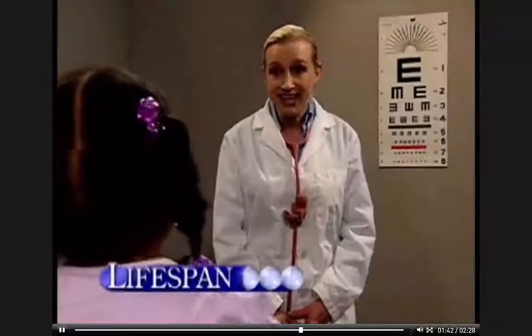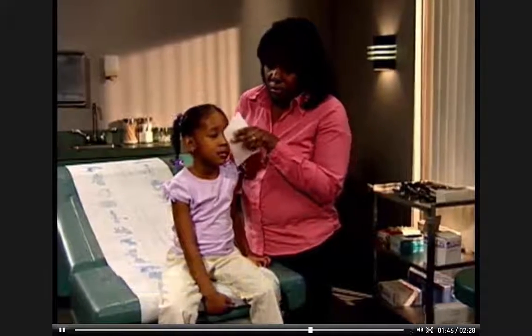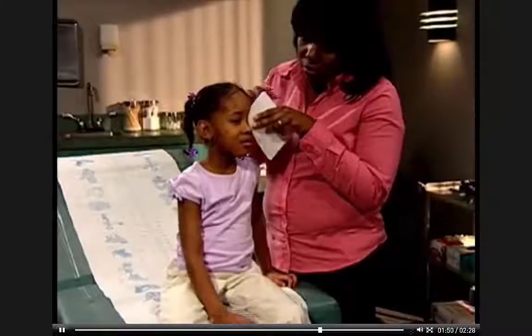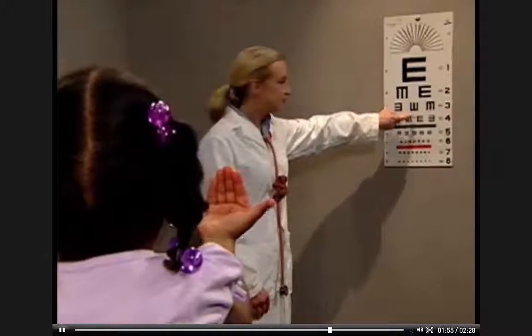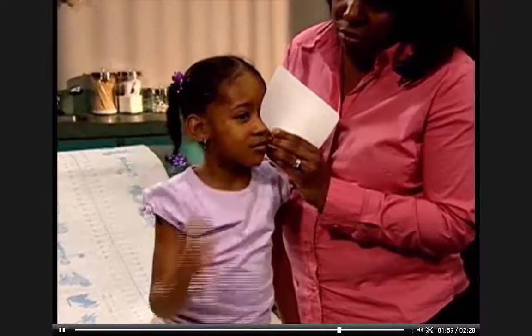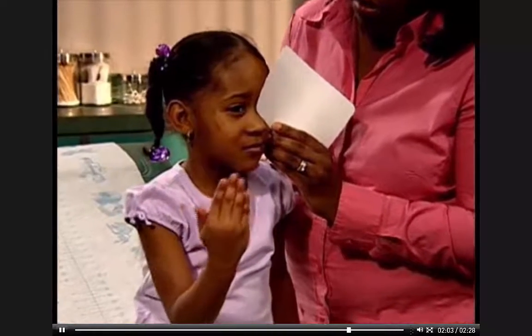Are you ready to play the E-game? Yes. Good. Okay, Mom, if you could cover up one of her eyes. For a child or an adult who doesn't read English, use a Snellen E-chart to test visual acuity. Good. While you stand at the chart, have the child point her arms or fingers in the direction of the legs of the E. That's right. You may need an assistant, such as the child's parent, to help her cover one eye.